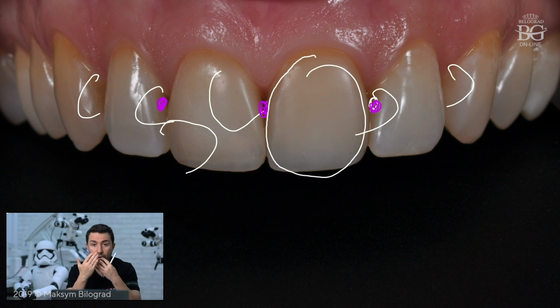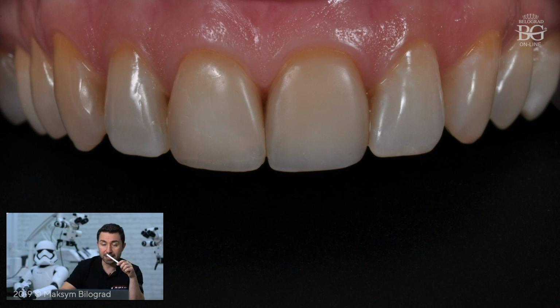In terms of the volume of teeth, we can be non-invasive, but considering the fact that we have composite fillings and caries defects, we have to open interproximal spaces and do type 2 and type 3 veneer preparations. Okay, so it is also important for us to understand this and to plan preparations in advance, to have a guideline for ourselves in order not to forget any single step that we have to apply during the process of treatment.